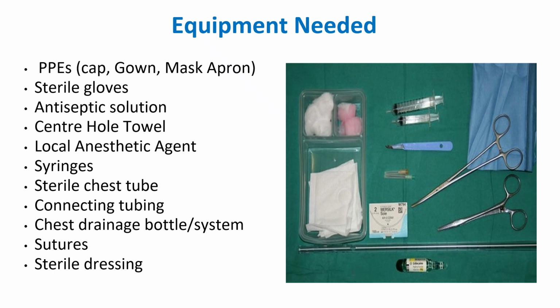So you start with PPEs. What will the doctor do? After hand wash, he will be putting on all the PPEs, right? Cap, gown, mask, apron, all those things. So you need to keep the PPEs. Next, you need to take the sterile gloves of the required sizes.